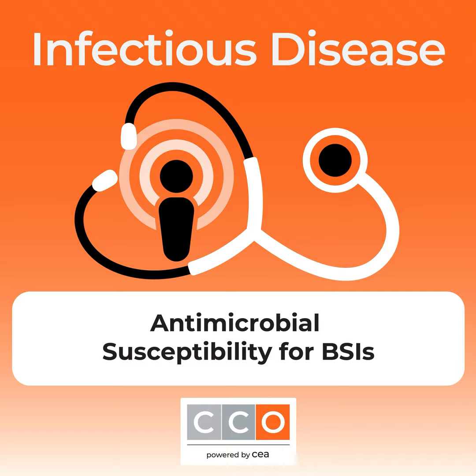Specifically for non-fermenters, it is very difficult. If you find a blaKPC in Pseudomonas, there is carbapenem resistance. But if you don't find a blaKPC in Pseudomonas, that doesn't mean that the Pseudomonas could not be carbapenem resistant. Genetic markers are unreliable for the non-fermenters group.